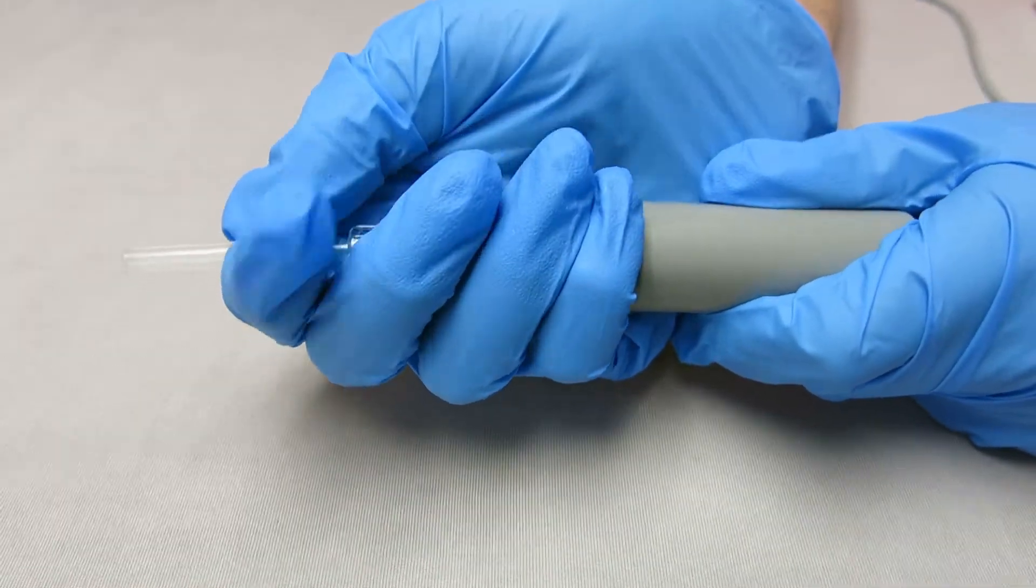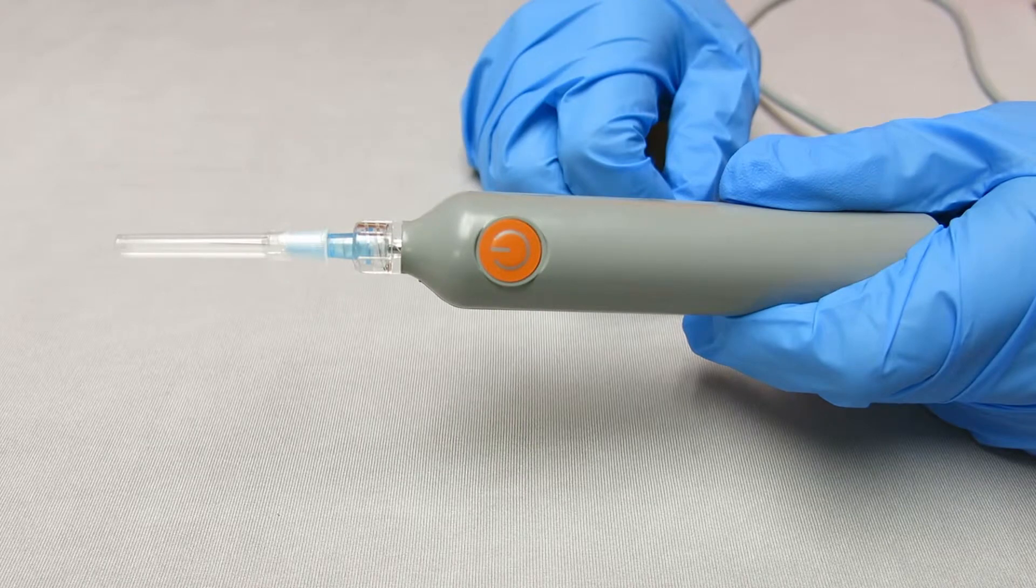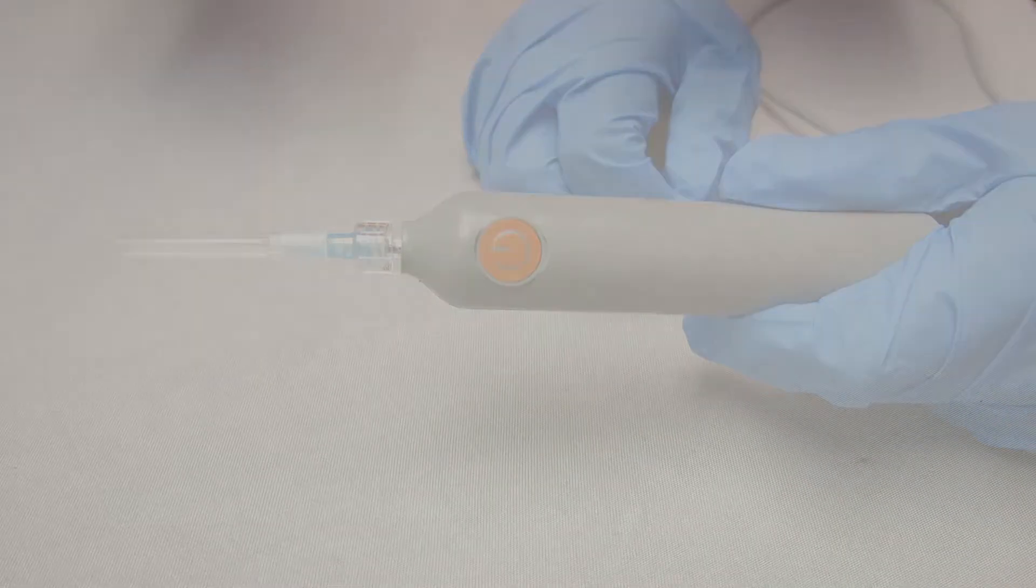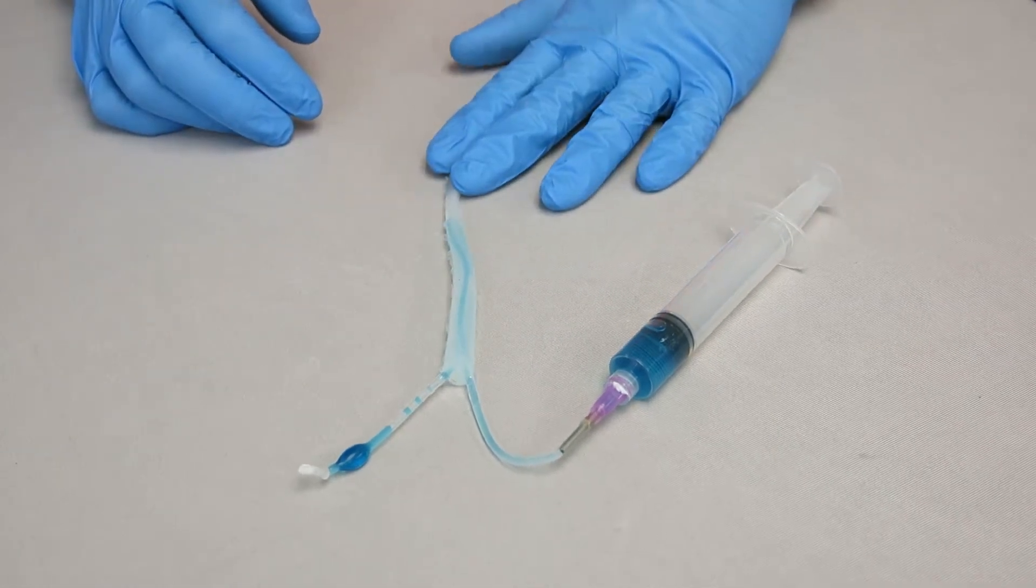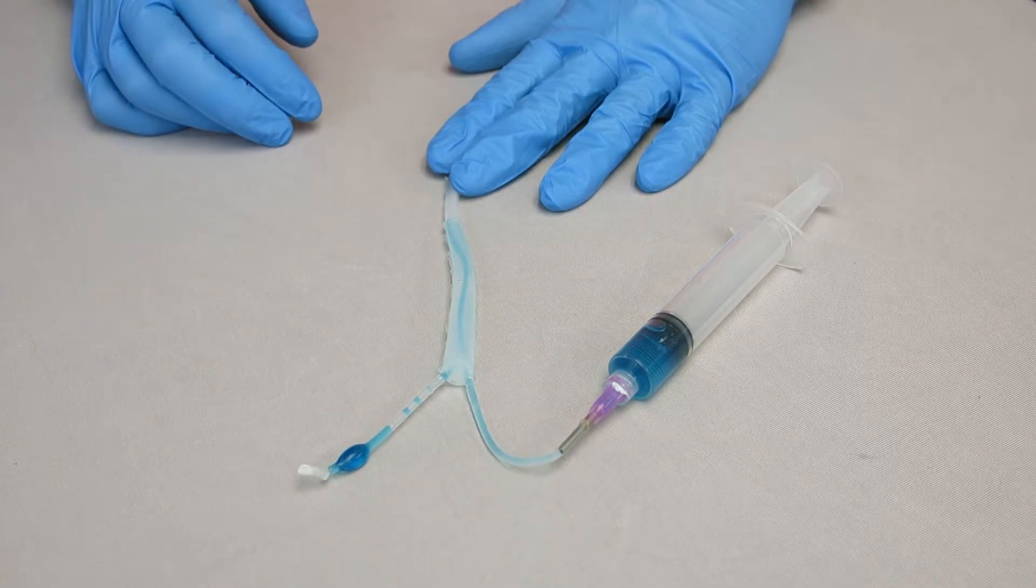Loosen the cap from your sharp and place the device to the side with the cap still covering the sharp. Secure the rodent according to your facility's policies and protocols for anatomical site access for blood sampling.